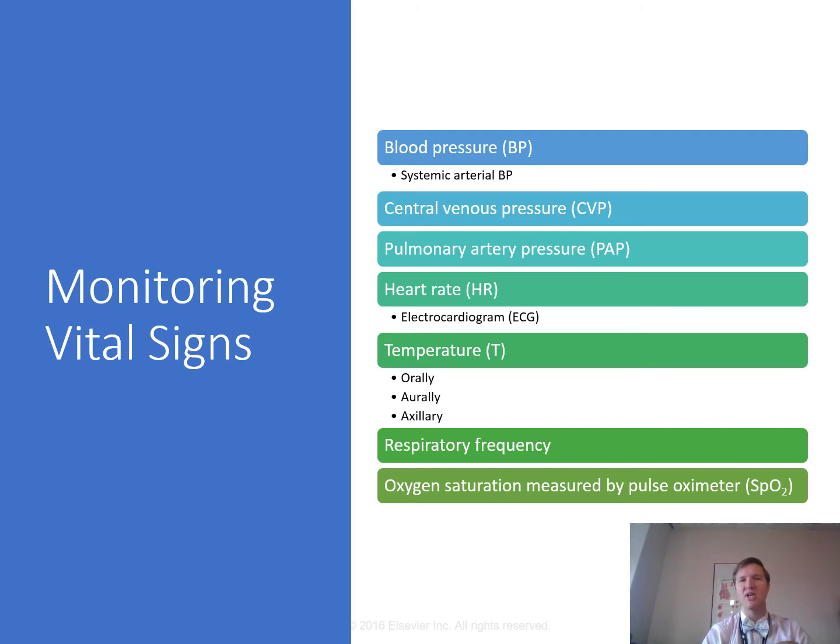In mechanically ventilated patients, respiratory rate, heart rate, and pulse ox are usually continuously monitored. Temperature and arterial blood pressure also may be monitored continuously, but more often they're measured intermittently. It is important for you to remember that the alarms are activated only by critical changes. Moderate changes in vital signs during hourly or bi-hourly checks usually alert you if there's the possibility of hypoxemia or impending cardiovascular collapse, like the blood pressure and heart rate go down or end-tidal CO2 drops suddenly, or an infection, right? They start having elevated temperatures.